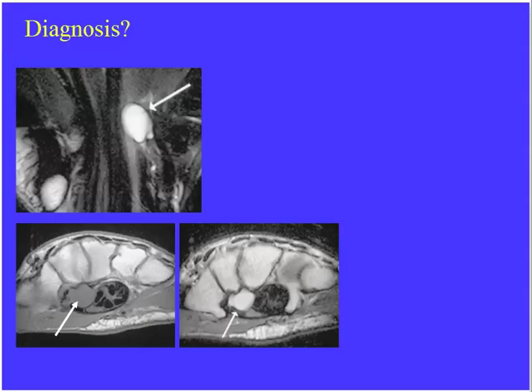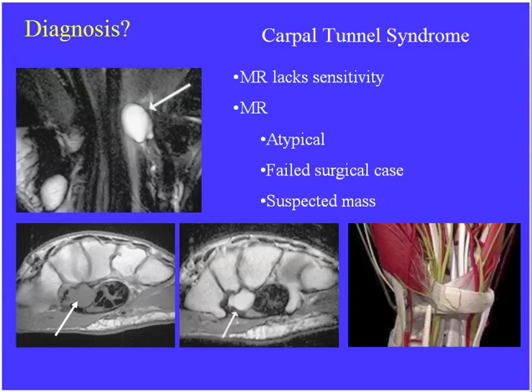Here's a diagnosis from an axial view through the wrist — the carpal tunnel. A focal mass within the carpal tunnel that is bright on T2 and low signal on T1 follows water signal — this represents a ganglion within the carpal tunnel. MRI is not routinely required for carpal tunnel workup; it's indicated for atypical presentation, failed surgical cases, or suspected mass. For run-of-the-mill carpal tunnel syndrome, MR has little to offer. The nerve involved is the median nerve.